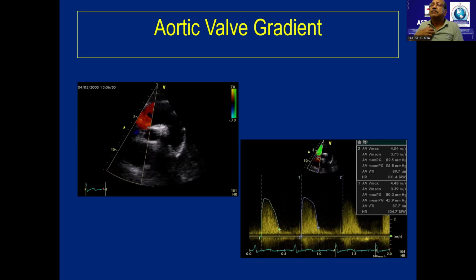So what I'm doing is bringing more of the aorta to the front. It came by surprise. One day the patient was not putting a pillow behind the shoulder, he was just putting the pillow again and again behind the right shoulder. We found that window to be very useful. Ever since then, we always use that window.